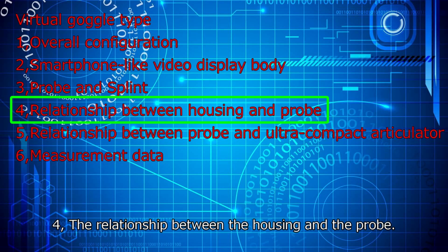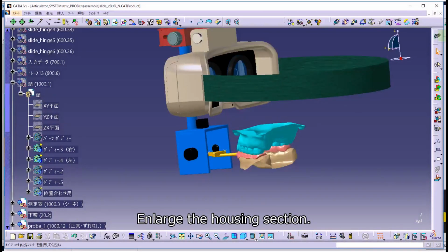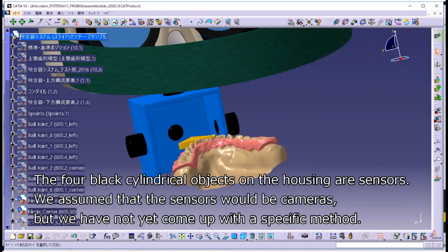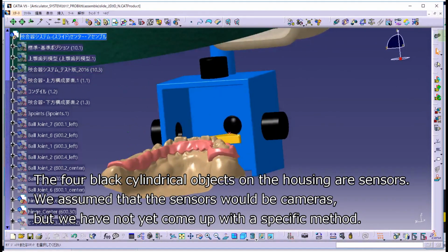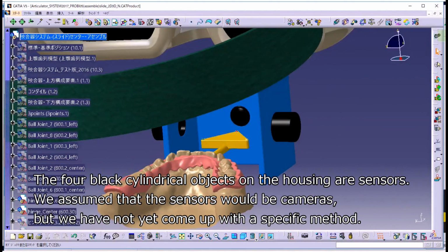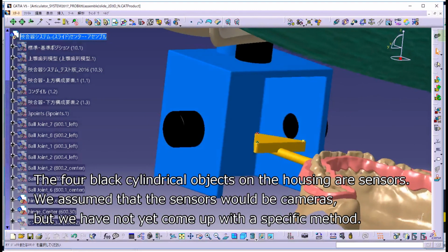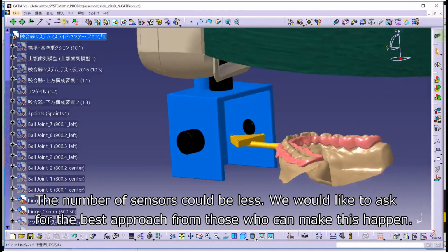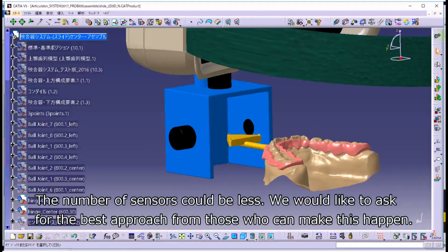4. The relationship between the housing and the probe. Hide the head. Enlarge the housing section. Hide the maxillary model. The 4 black cylindrical objects on the housing are sensors. We assumed that the sensors would be cameras, but we have not yet come up with a specific method. The number of sensors could be less. We would like to ask for the best approach from those who can make this happen.